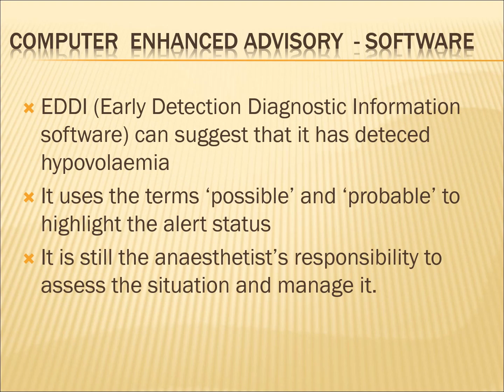By using pathophysiological reasoning, 5-minute median value windows, and odds calculation, it is possible to suggest a diagnosis for hypovolemia. Together with a high PPV, the diagnosis can be strengthened. However, the anaesthetist is the final arbiter.